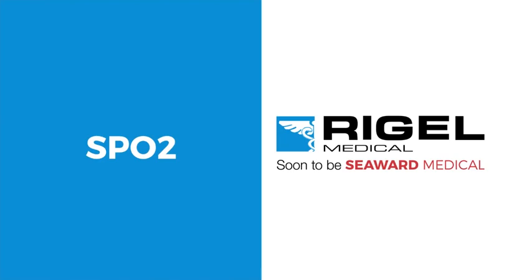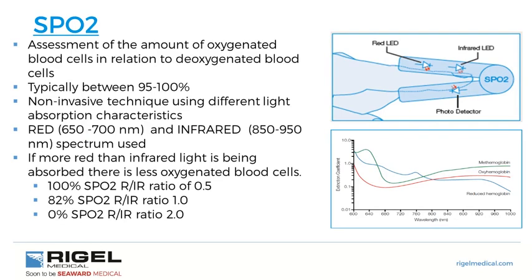So, SpO2 is the assessment of the amount of oxygenated blood cells in relation to deoxygenated blood cells. And in a healthy patient, typically 95 to 100%. It's a non-invasive technique using different light absorption characteristics, where we have a graph there at the side where we have red waveform, which is typically 650 to 700 nanometers, and infrared, which is typically 850 to 950 nanometers.